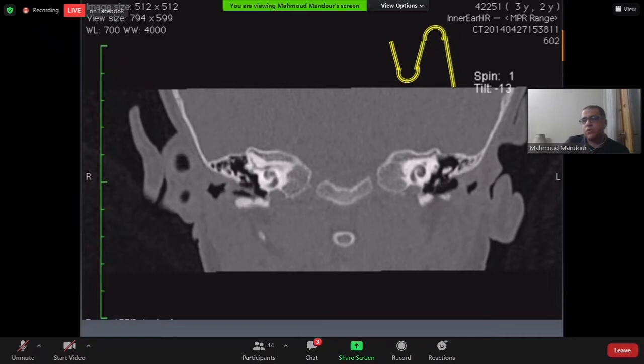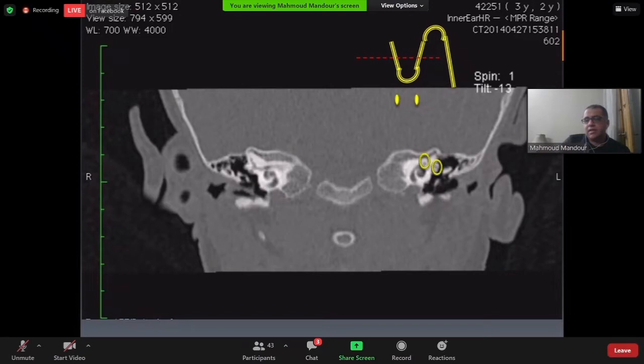The coronal cut typically cuts both the labyrinthine and tympanic segments of the facial nerve, so they both appear as two dots. The medial dot is the labyrinthine segment and the lateral dot is the tympanic segment of the facial nerve.